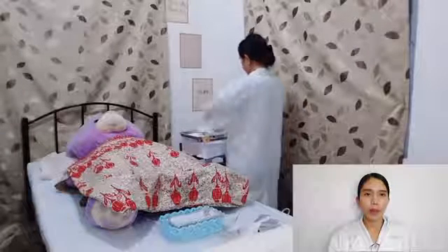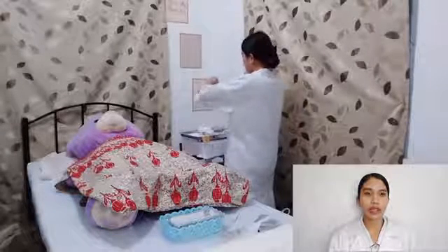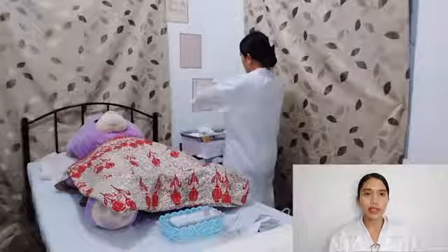Open the wrapper or plastic cover of the sterile specimen bottle and drop it on the sterile field.